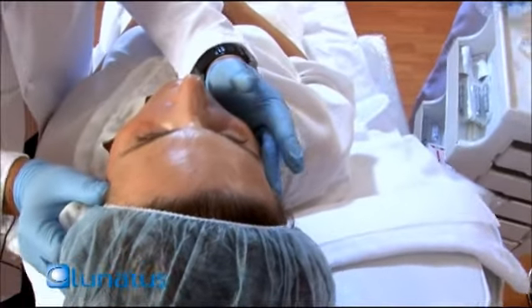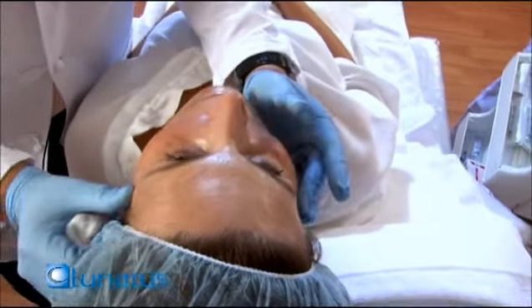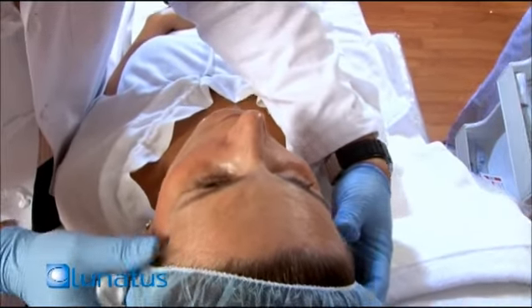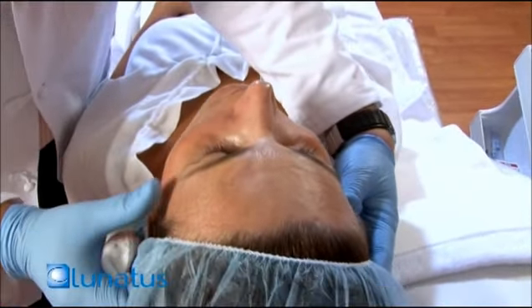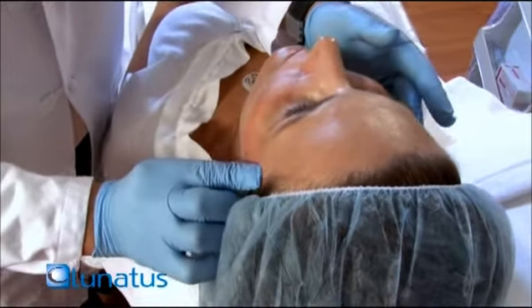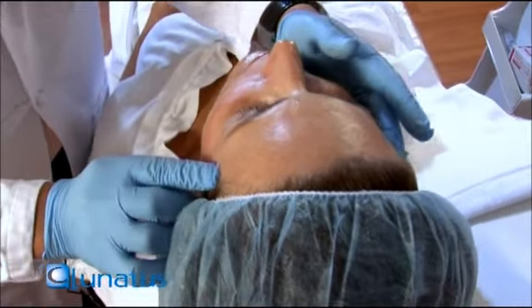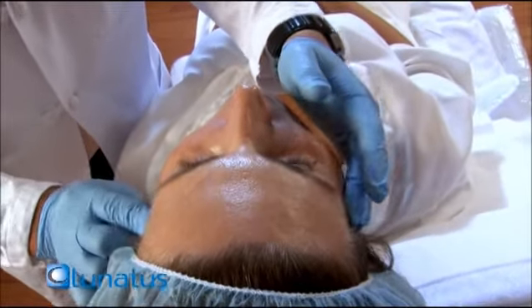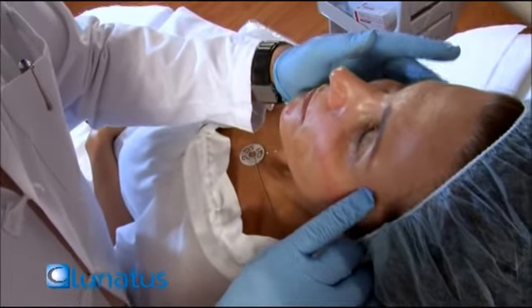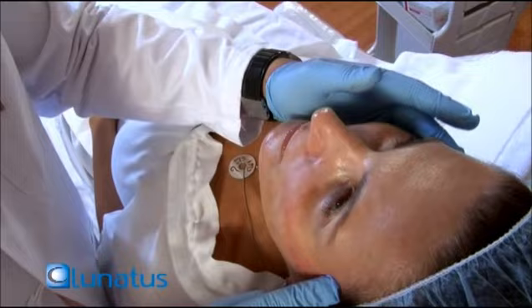Cheeks very well enhanced. Roberto, did you feel anything? No. No pain. Very good. As long as you have patients who are not complaining of pain, then you're golden. Roberto is a very patient patient.